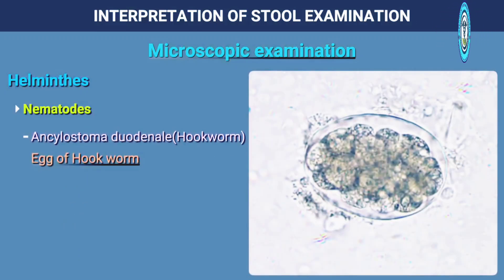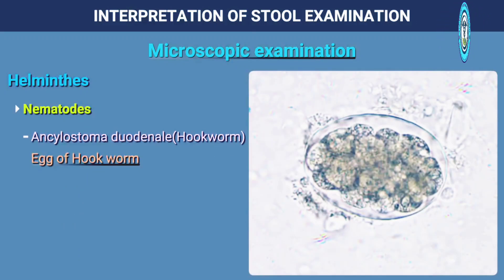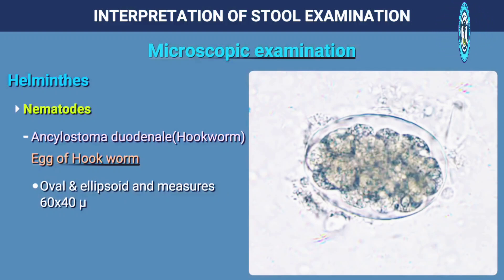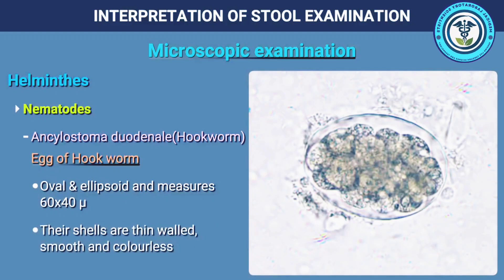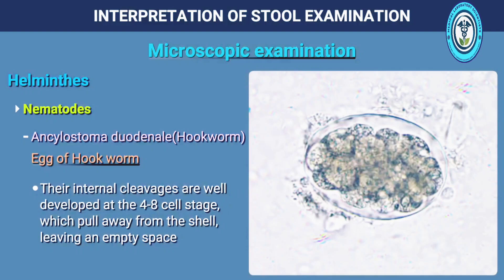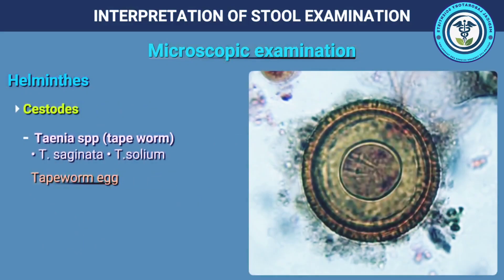Ancylostoma duodenale, or hookworm: the egg is oval and ellipsoid and measures 60 by 40 microns. The shells are thin-walled, smooth and colourless. Their internal cleavages are well developed at the 4 to 8 cell stage.